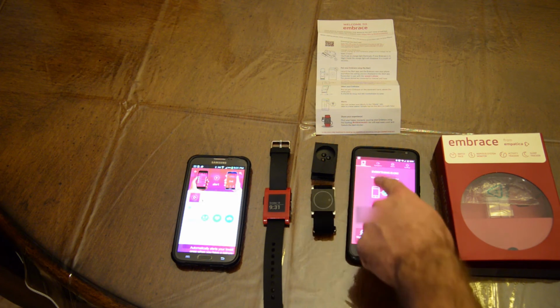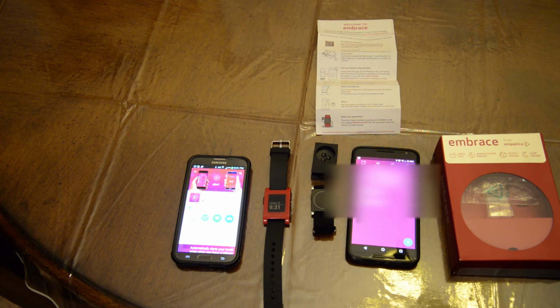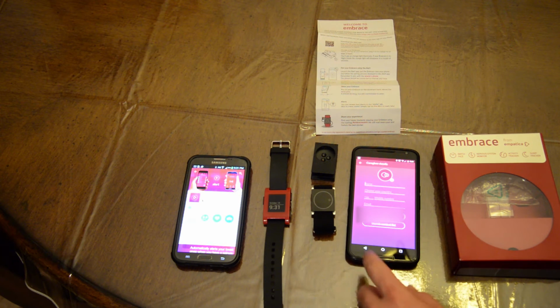Once you've loaded this, you can add Caregivers right here. You just hit that plus sign, and add in their name, phone number, country, and email as well.